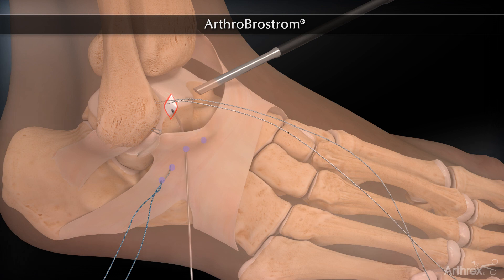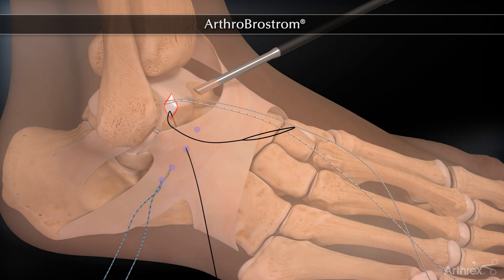Alternatively, using the microsuture lasso, an outside-in technique can be performed to shuttle the two remaining suture limbs.